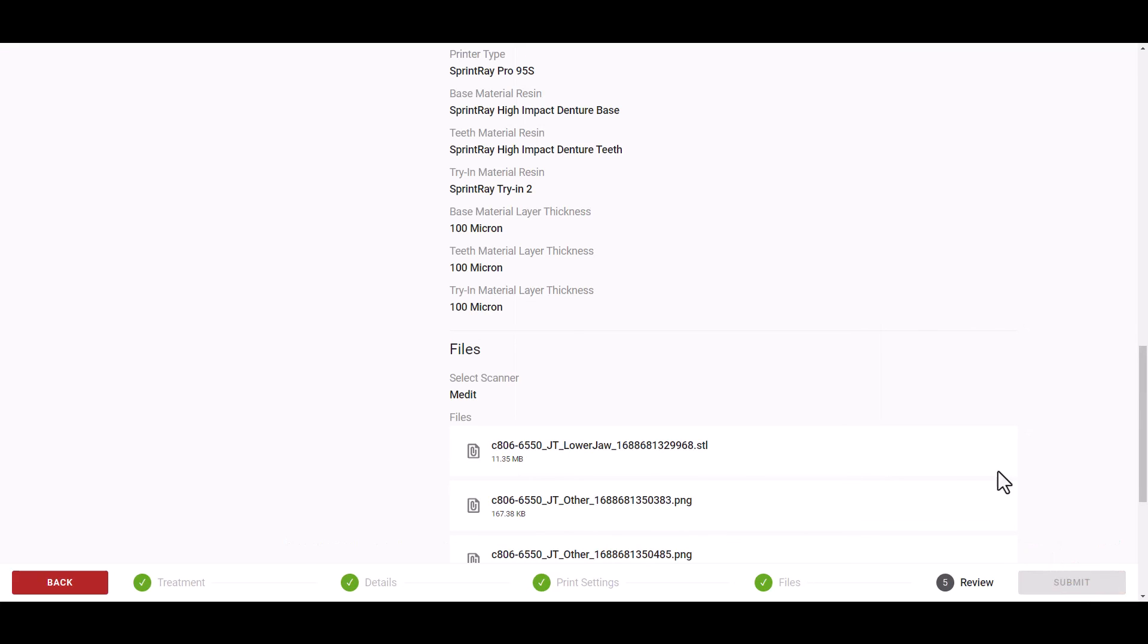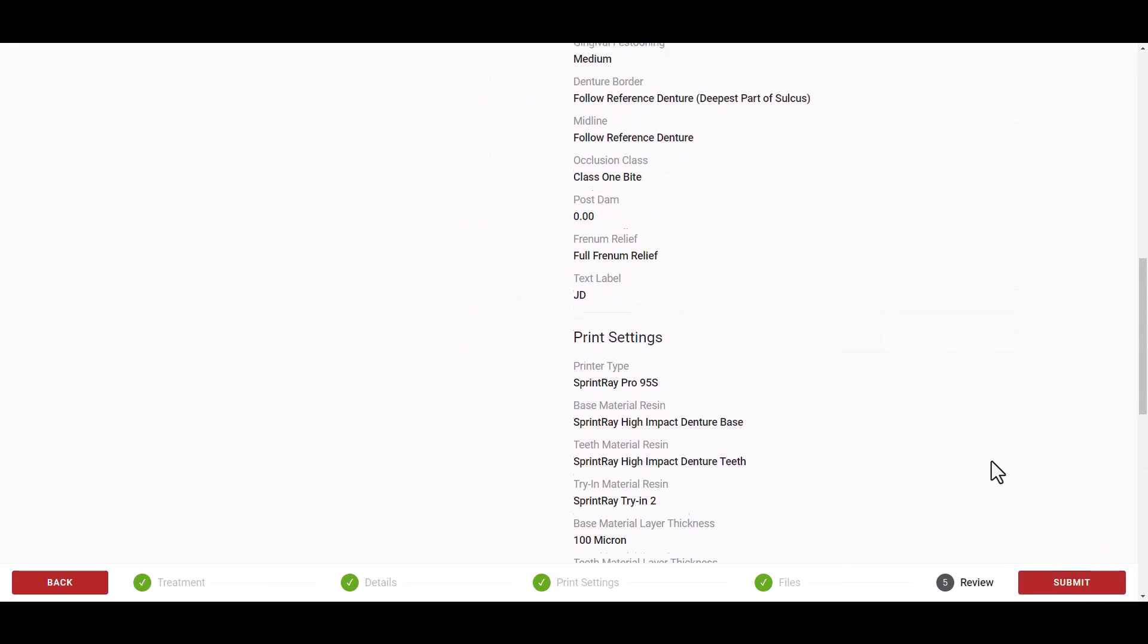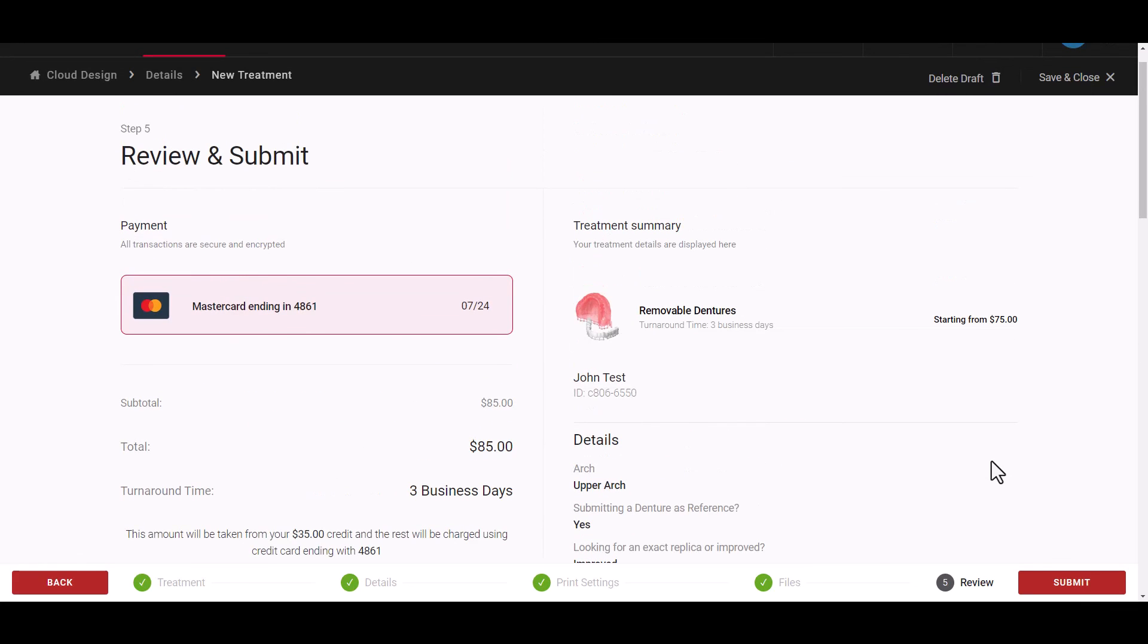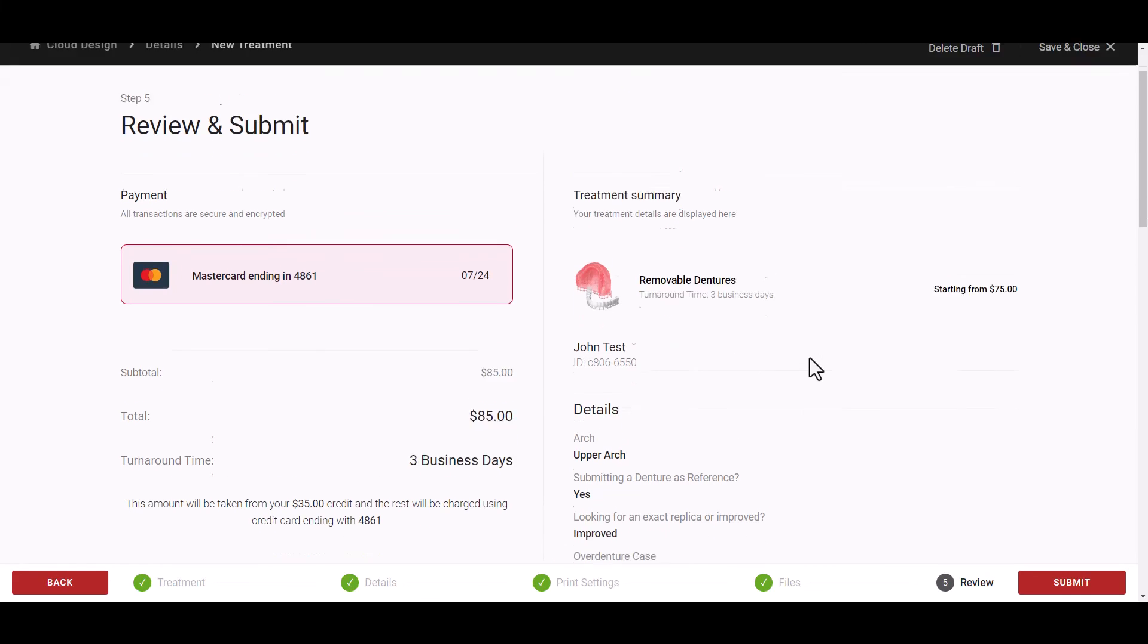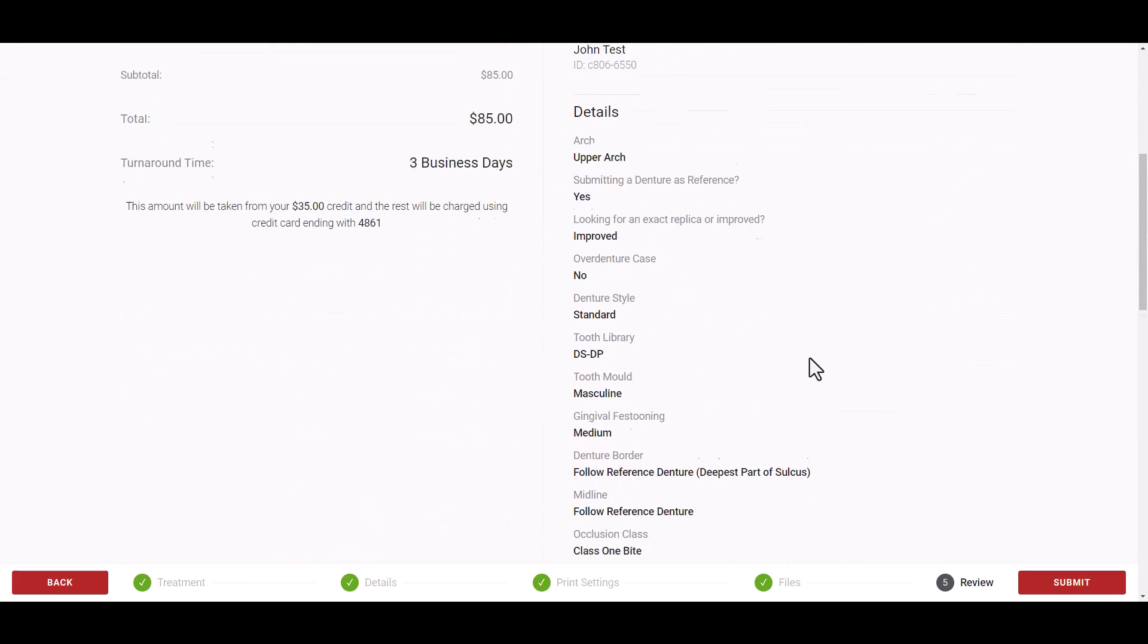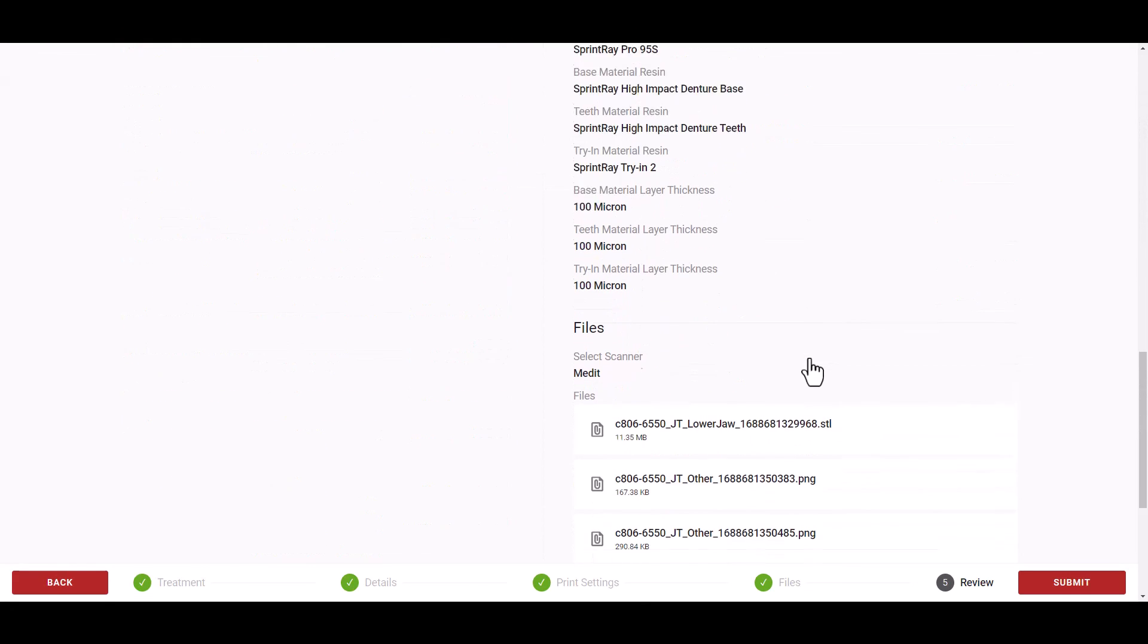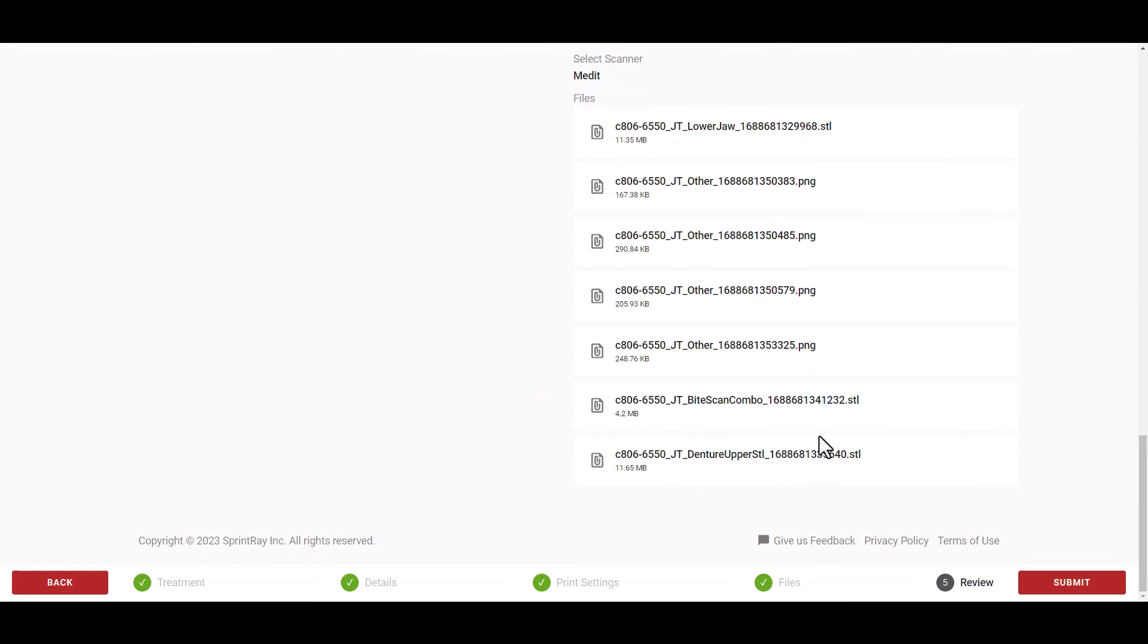The review stage will show all of the options that you have selected and show the total amount that will be charged to your credit card linked to your cloud design account. Here you can review all the selections as well as the files that you have uploaded for this treatment.